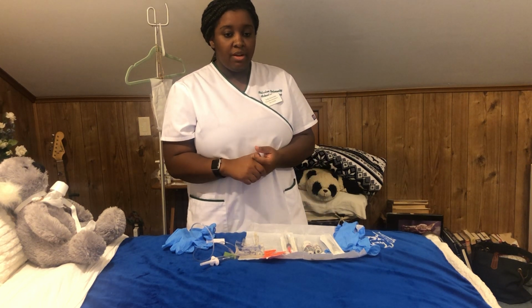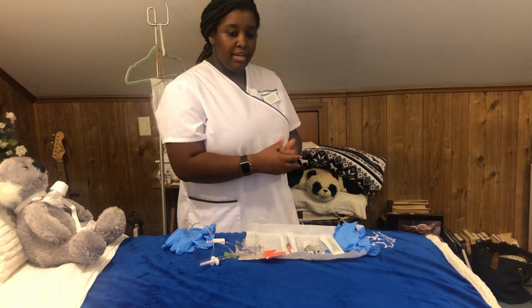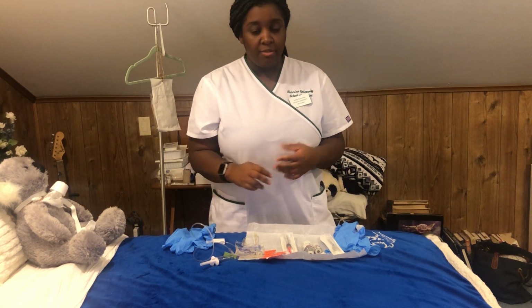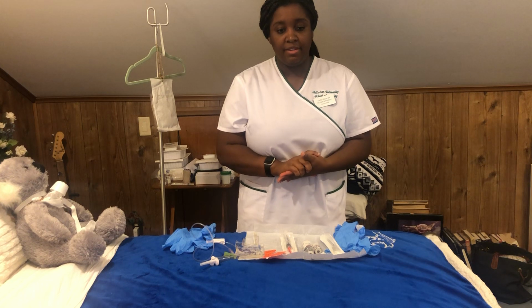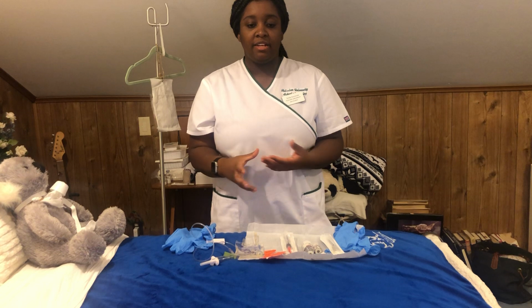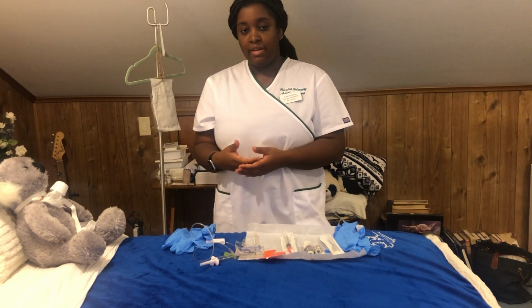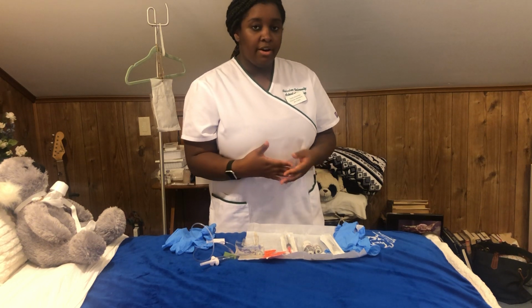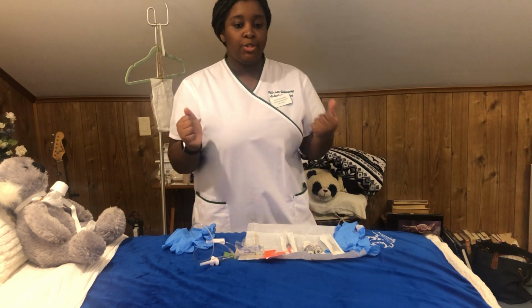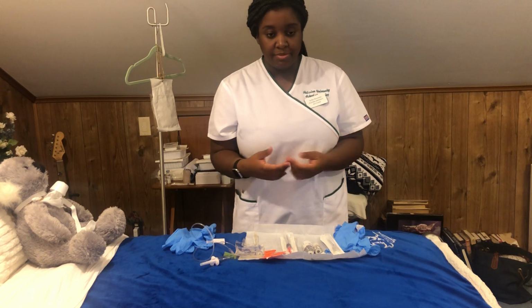So continuing on, I will go in and get my medication for vancomycin. Now, because this is an IV fluid, mixing fluids, I have to check the compatibility of vancomycin to the other IV fluids the patients are already on. And according to the MAR, the patient does not have any incompatibility with NS or LR, so I will now move on to my medication preparation.